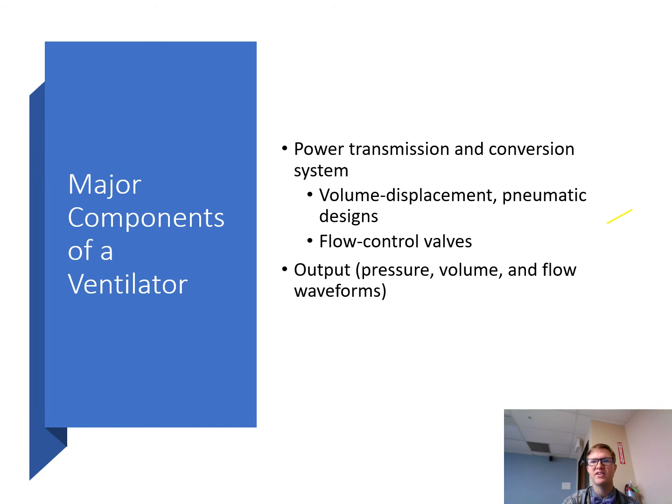Your most modern day ventilators, from the Puritan Bennett 840 to the Galileo, which we have in our lab, and even the newer modern ones also have that ability. Even a lot of these will have a digital on-off configuration, so the valves can operate together.